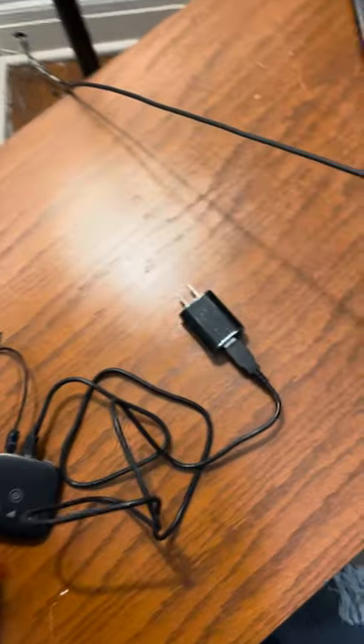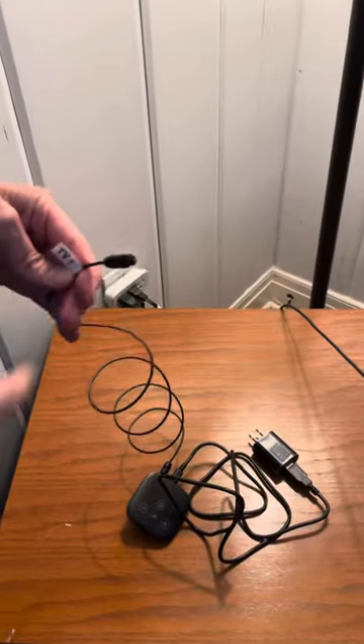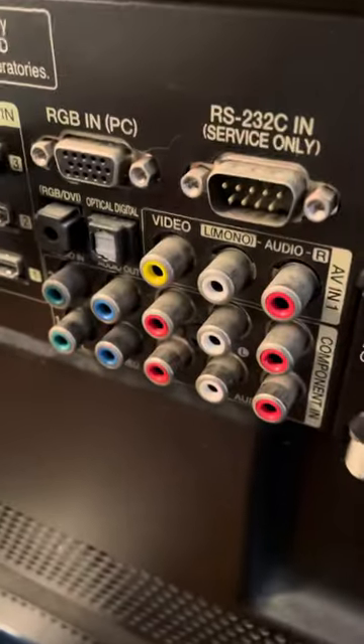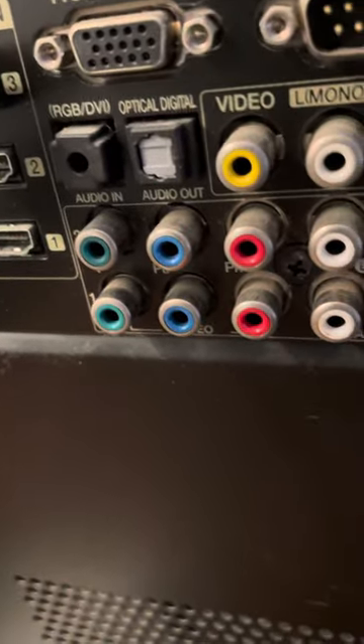The first thing you're going to want to do is plug the digital audio out cable in. That's going to go into the digital audio out port on your TV, and you will see it might say 'digital audio' or it might say 'optical digital audio out.' That's what you want.